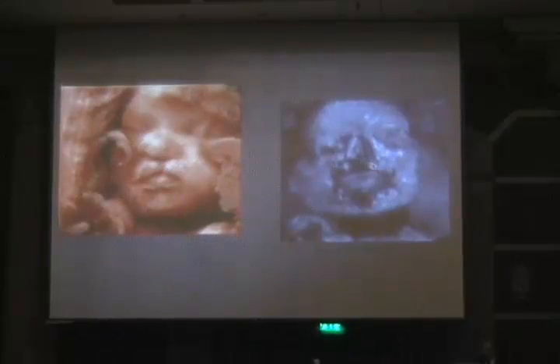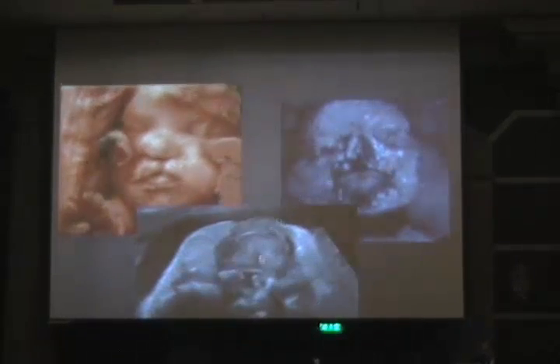I saw a cleft lip here. I said to the patient, it's not very important. And I was looking, I saw here in the nasal bone a problem, and I looked especially here. This is the tongue, and you see here that there is a cleft palate. You see there is a discontinuity in this palate. So I said, okay, it's more than normal.